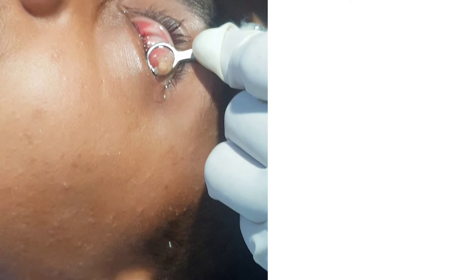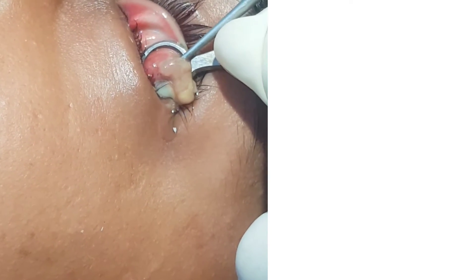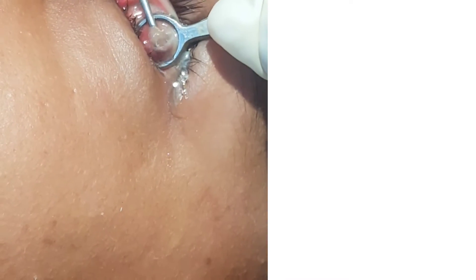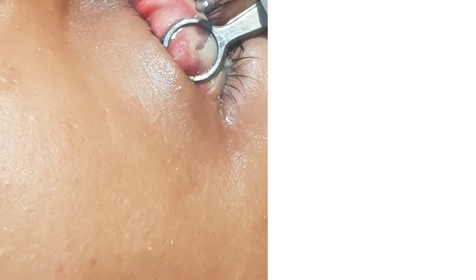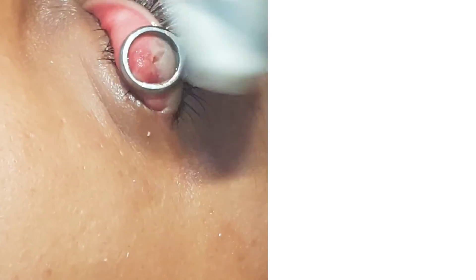If your incision is deep enough, you will see some gooey material come out through it. Then a chalazion curette, also known as a chalazion scoop, is taken and used to scoop out the contents of the cavity. After making sure that the cavity is clear and empty, we loosen the clamp, remove it, put antibiotic ointment inside the eye and bandage it. The bandage can be opened after 2 hours.